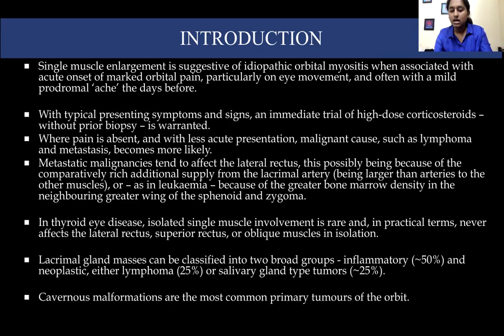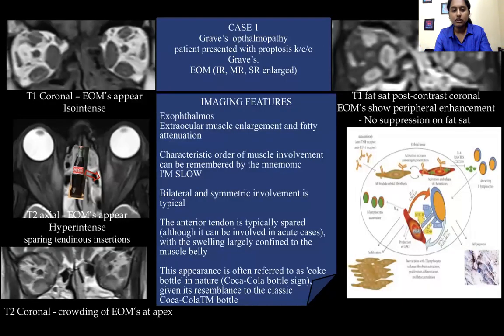My first case is a patient with Graves ophthalmopathy. The patient presented with proptosis and is a known case of Graves disease. On imaging, we can see enlargement of the extraocular muscles — the inferior rectus, medial rectus, and superior rectus — with bilateral symmetrical enlargement of these muscles.